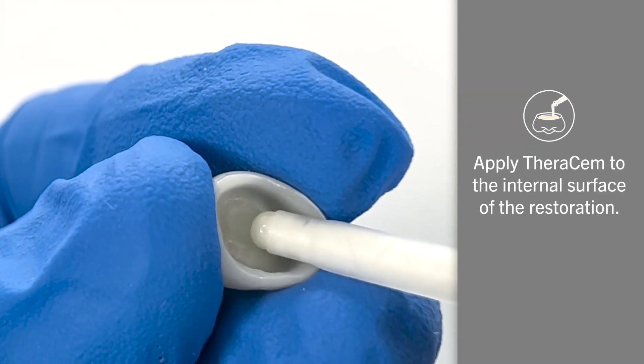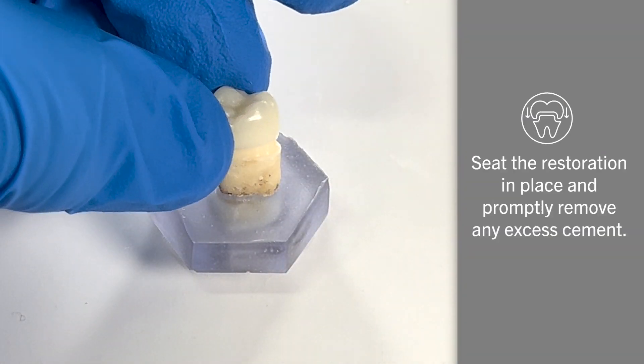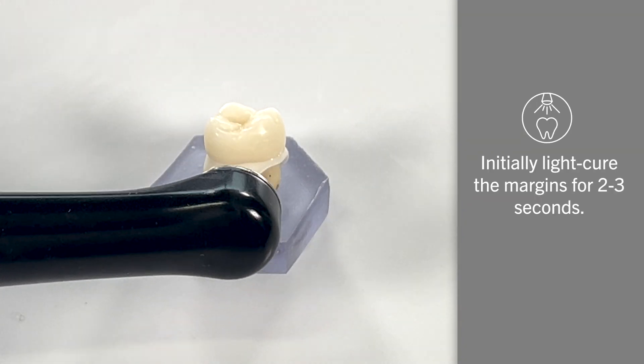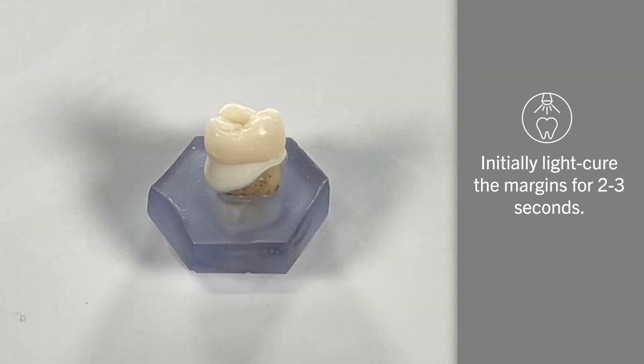Next, apply Therasem to the internal surface of the restoration, seat the restoration in place, and promptly remove any excess cement. To enhance the ease of removing excess cement, it is recommended to initially light cure the margins for 2-3 seconds.